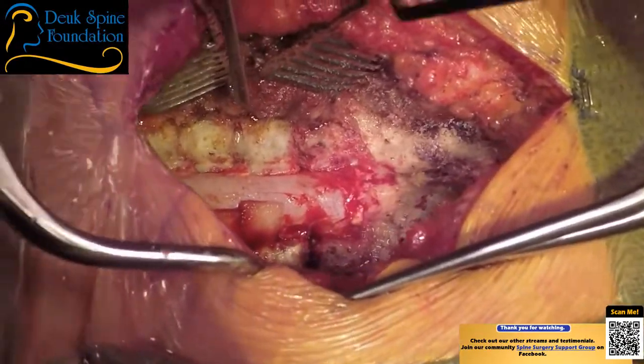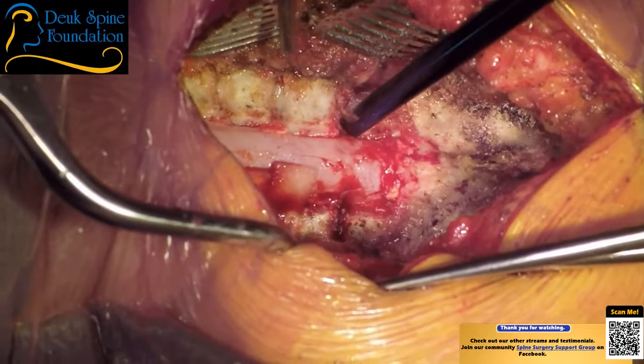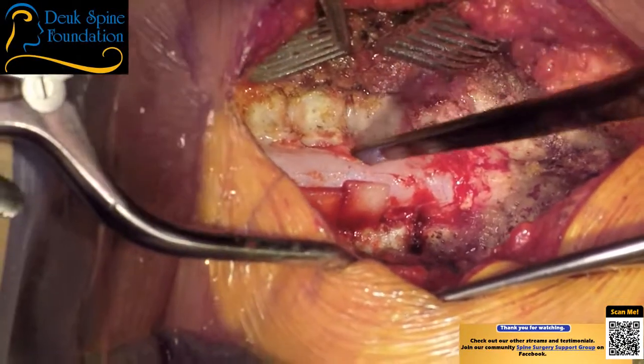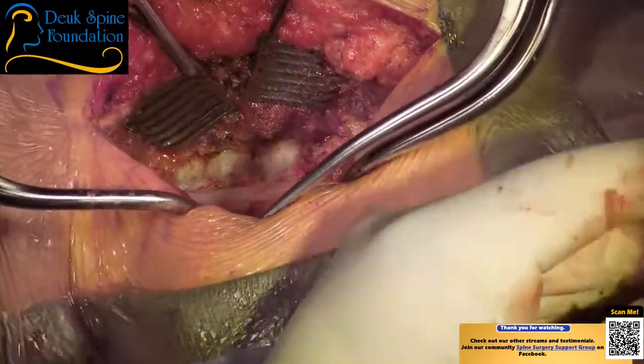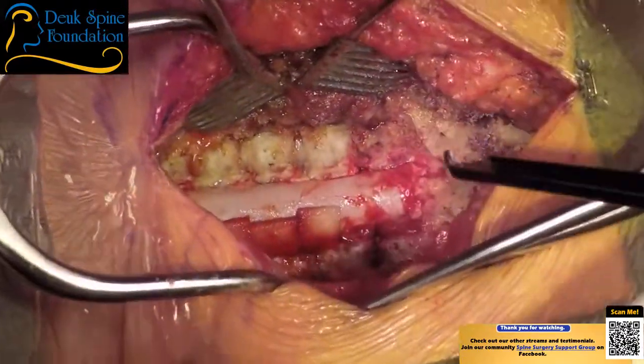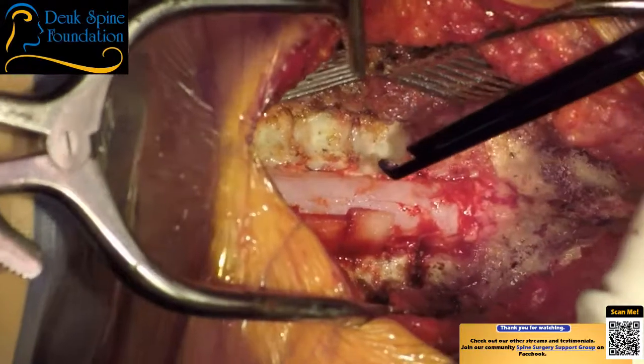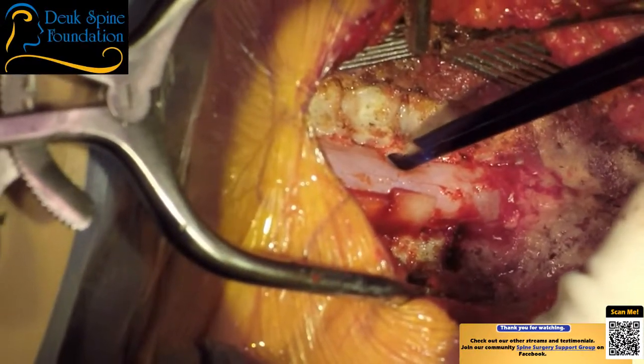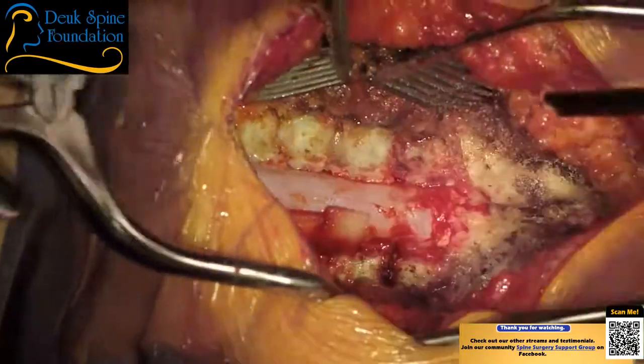There's the back of the foramen. It's totally open. Nothing pushing on the nerve root. Now go to the next one. It's got thickened ligament as well. Are you allowed to push on the dura a little bit? Yes. Okay, but what I do is I make my goal no pressure on the dura, and then inevitably you have to, because you can't do a foraminotomy without pushing on the dura.